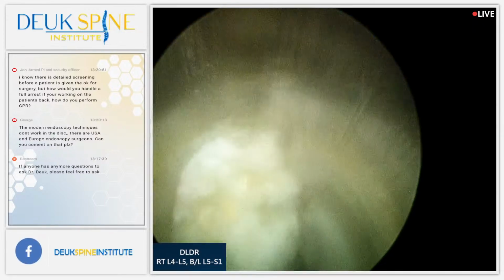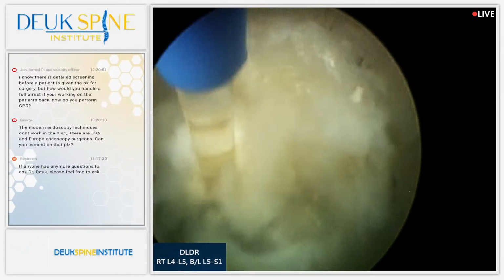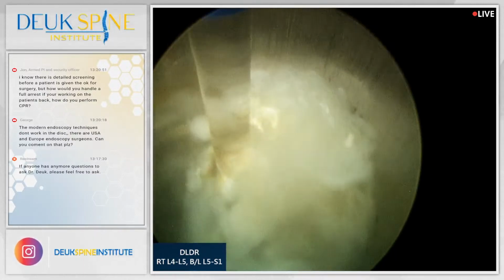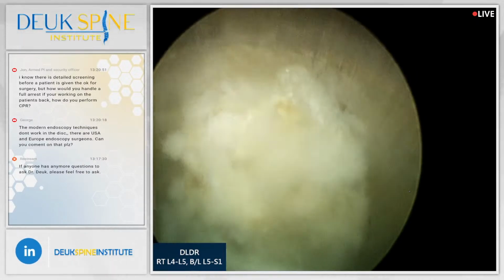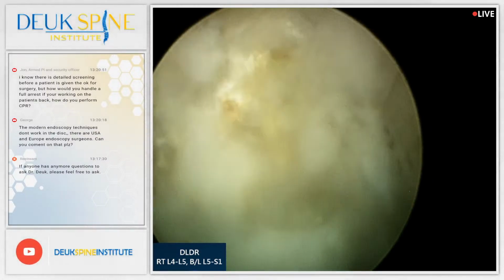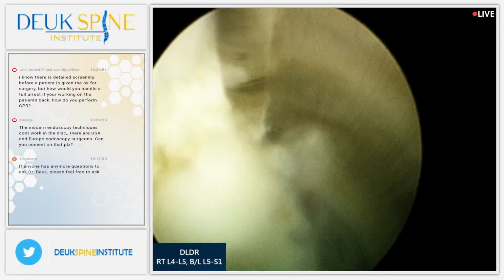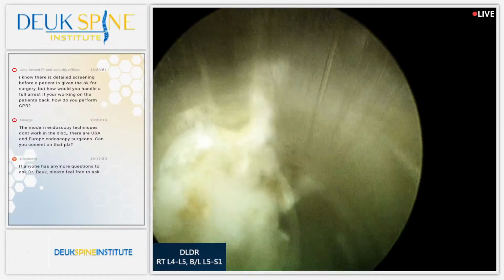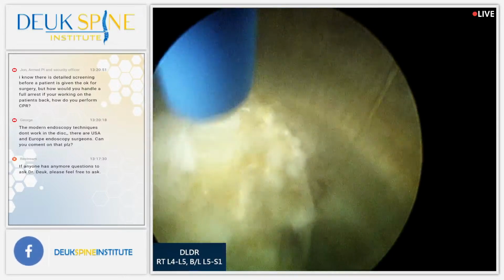All right, we are working on the herniation. This is it right here. Okay, I've been working on it. This is a different part of it. This is an old part, very scarred up. That's what this laser is hitting, this hard stuff. It's very firm. This is what was pinching his nerves, giving him weakness in his legs. You can see all the gold coloration, that's calcium. Should not be there, that's abnormal calcium. If it gets to be a lot, then we call it a bone spur.